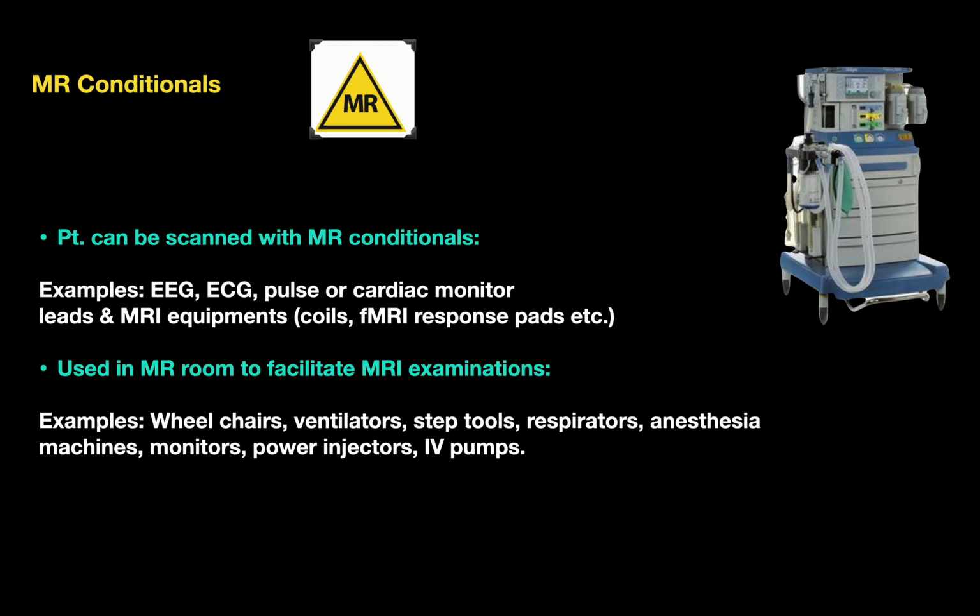So let's talk about the MR conditionals, which are highlighted in the yellow color. The patient can be scanned with MR conditionals like EEG, ECG, pulse or cardiac monitor leads, and MRI equipment like coils and functional MRI response pad. So these are the MR conditionals.